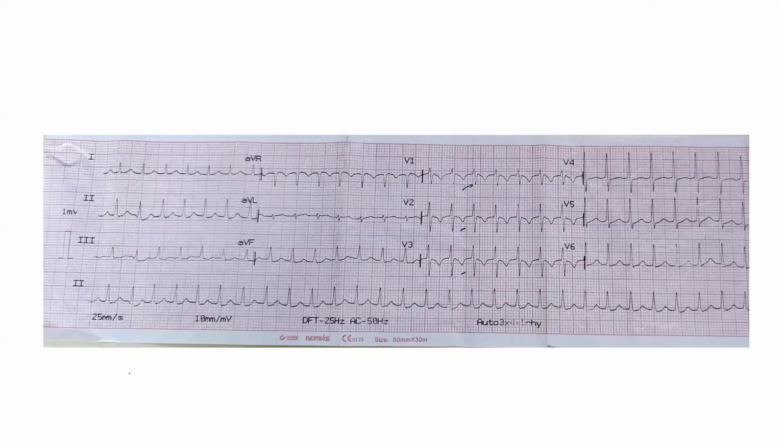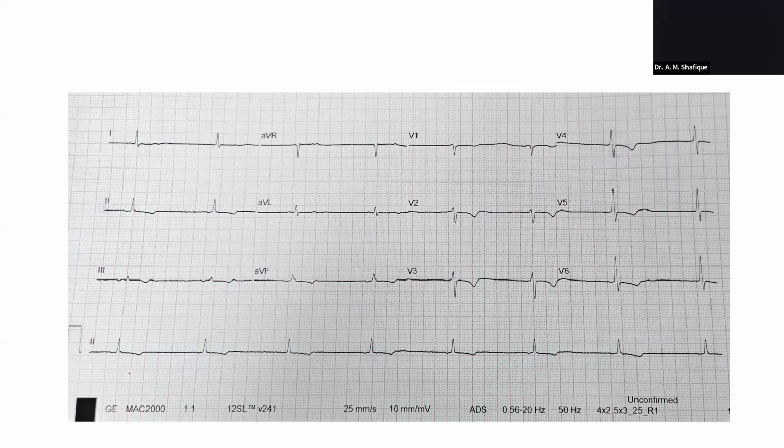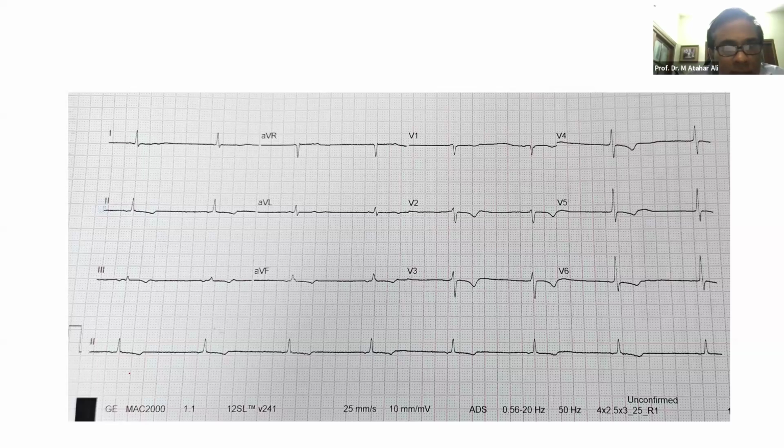Okay. Yes, sir. This latter ECG, that one with bradycardia, seems to be an ectopic atrial rhythm near the atrioventricular ring. True, Jamil, true. Because there are inverted P waves in the inferior leads. Inferior leads, right. True.